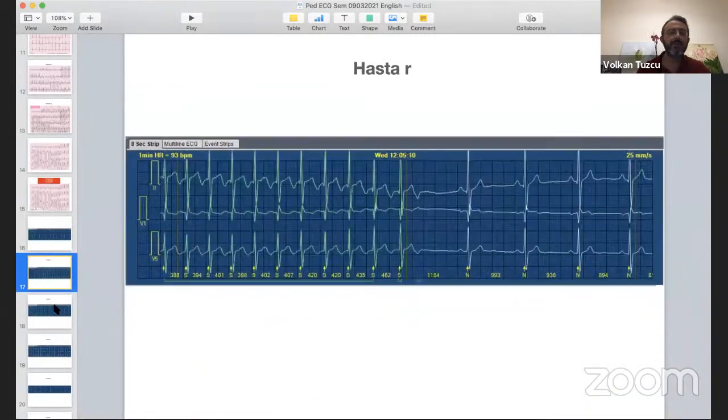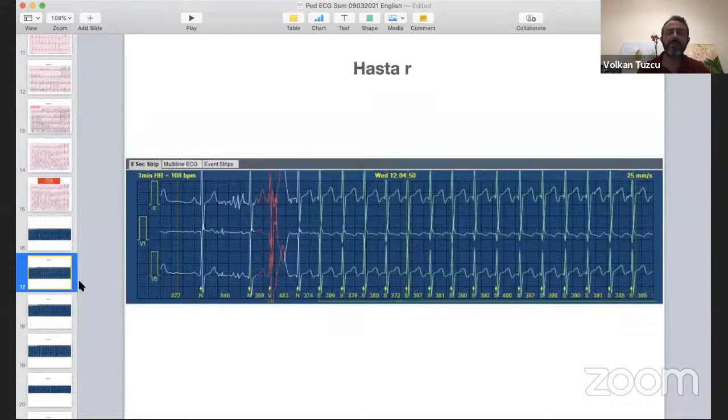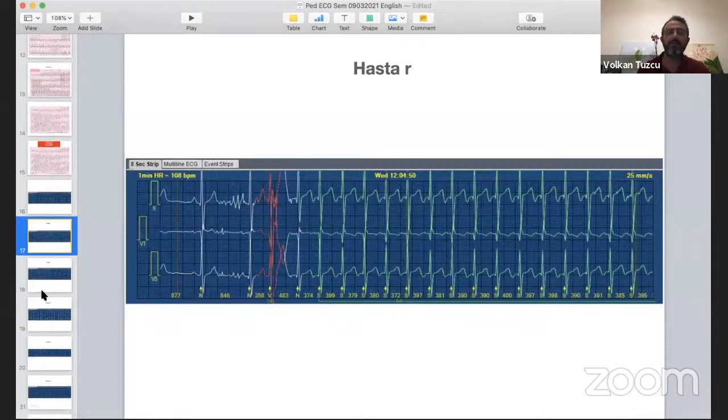All right. That's the onset of a tachycardia. So always, as we mentioned before, we have to focus on how a tachycardia starts. This is a narrow complex tachycardia, therefore it's SVT, not sinus, right? How does it start? With a wide QRS, possibly a PVC. There's too much artifact here, but most likely a PVC, unless it's an aberrantly conducted PAC.